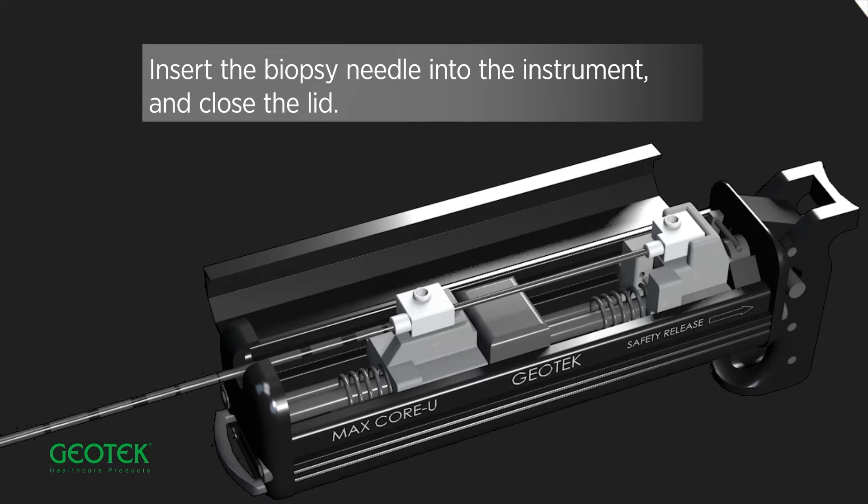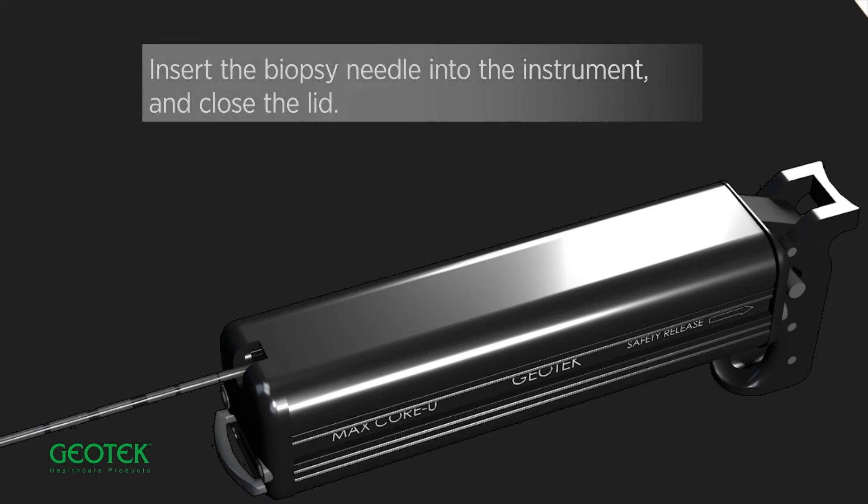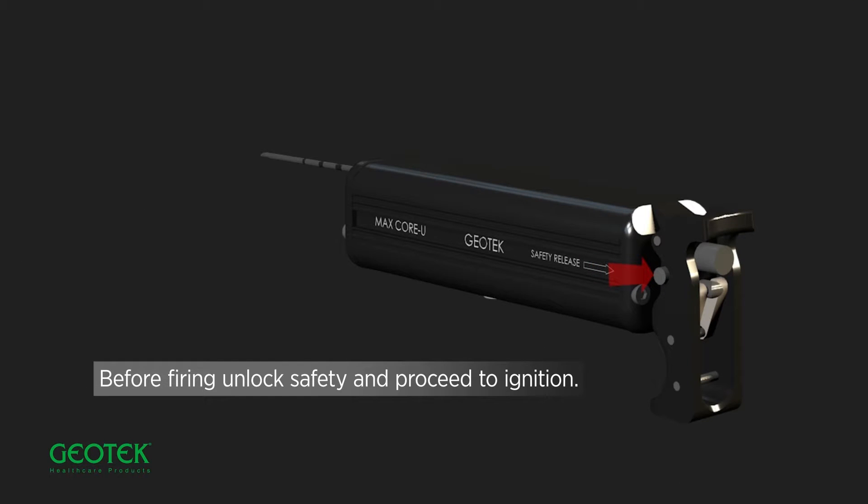Insert the biopsy needle into the instrument and close the lid. Before firing, unlock the safety and proceed to ignition.